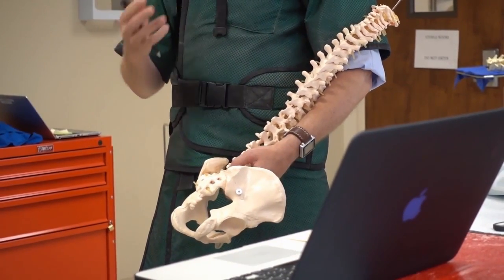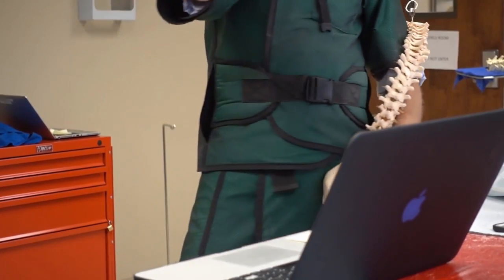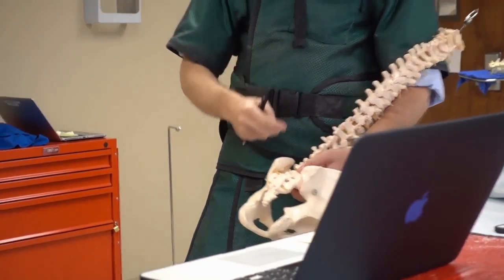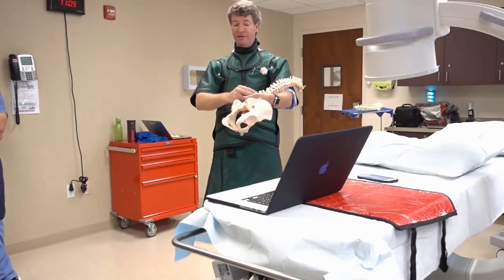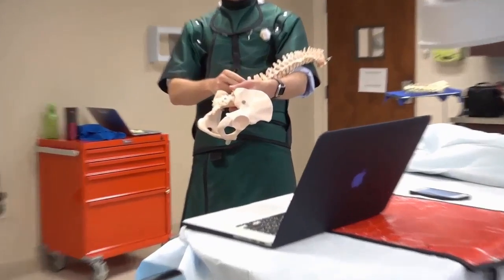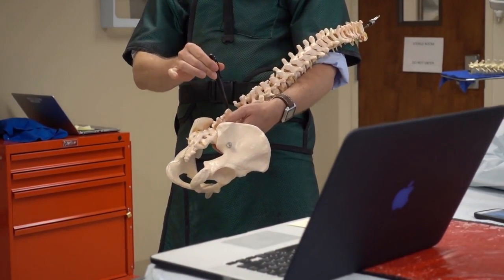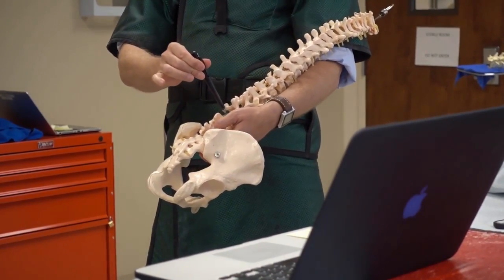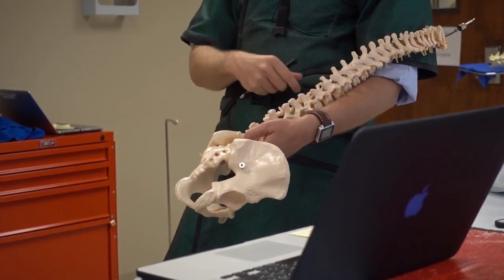Now, the patient's in essentially the same position, but our projection is going to be AP. And again, if we put a pillow under there to open up and bend the spine, you'll have even more space to get into for the interlaminar. What we generally do is numb the skin, put the needle down to the bone, and then walk off into the ligament, and then use what we call loss of resistance technique as we pass it through.